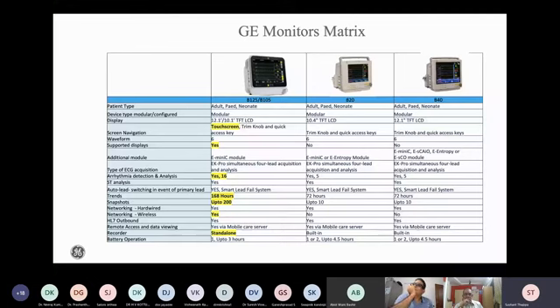And then if you want the display to be larger, you can of course hook in more displays. You can add in more modules. I'll quickly also go through a list of what modules can be added. The basic parameters include, of course, ECG, NIBP, SpO2, and to some extent you can add respiratory parameters, and later on you go into EtCO2 and larger parameters as well.